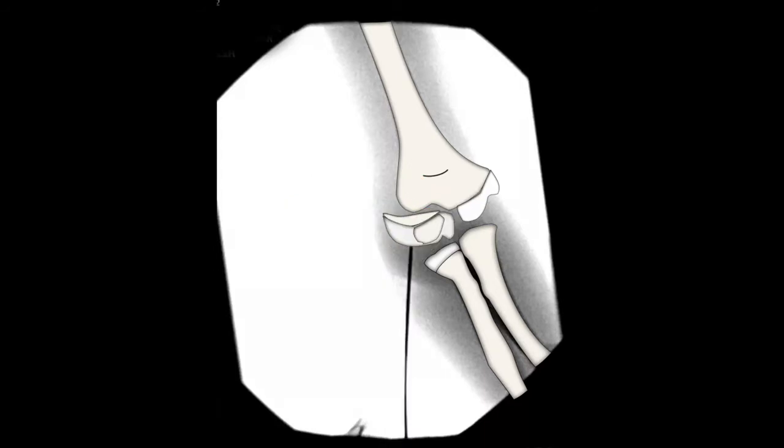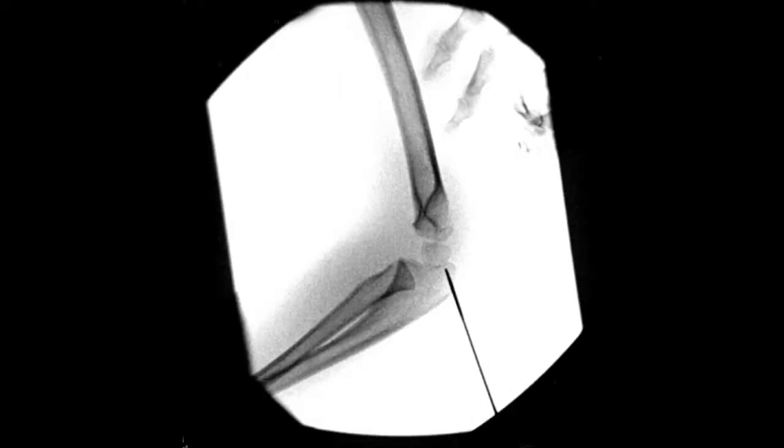The starting point for the guide pin is the lateral edge of the capitellar epiphysis on the anterior posterior view, just posterior to the midpoint on the lateral view.